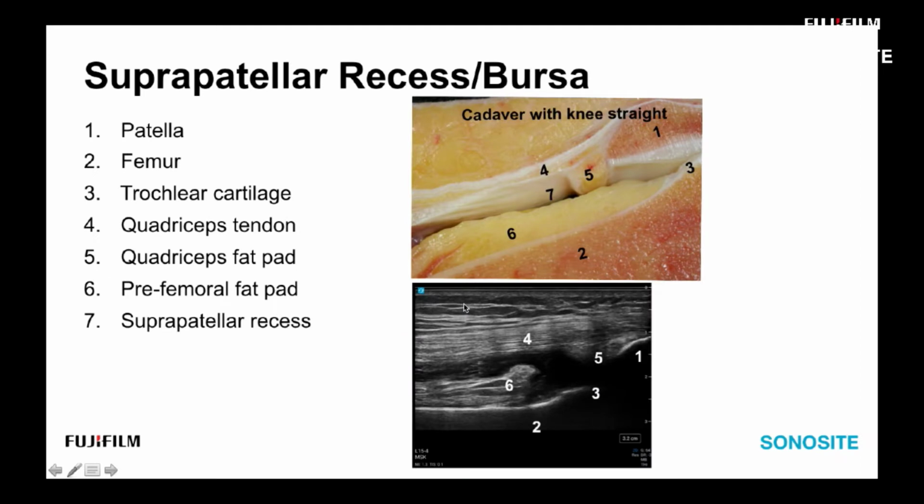Now let's talk more about the recess itself. This cadaver slice was probably the most illustrative for me to learn and just show how large and far proximally running this recess is. So the knee joint is a large target, but there's no need to run a needle near the hyaline cartilage, whether you're going subpatellar with your needle or if you're going infrapatellar and driving the needle under Hoffa's fat pad, hoping to hit the recess there. You could be scuffing cartilage at that approach too.